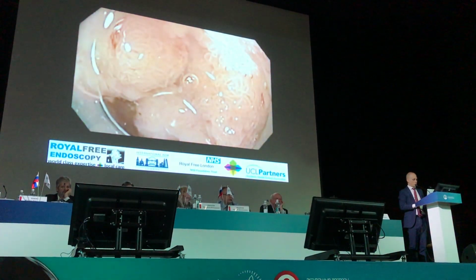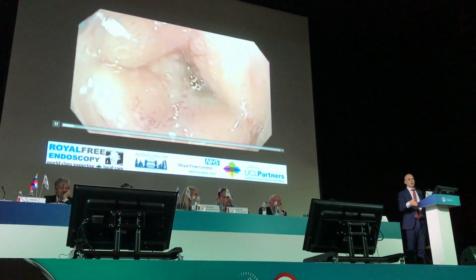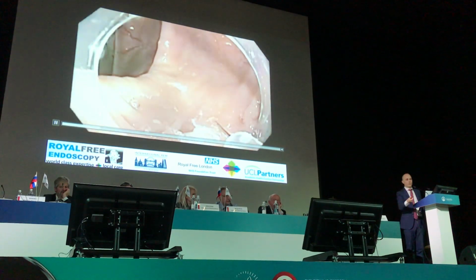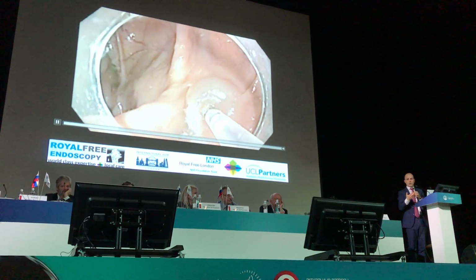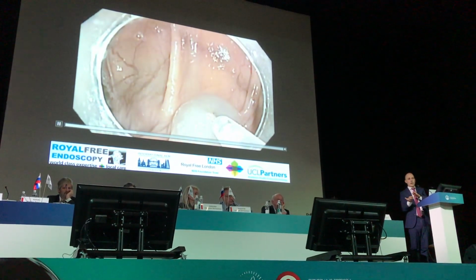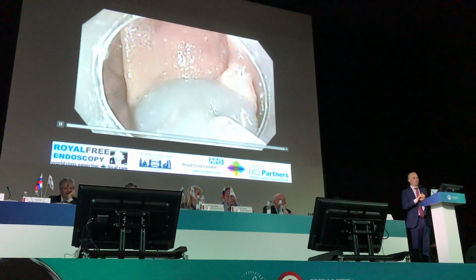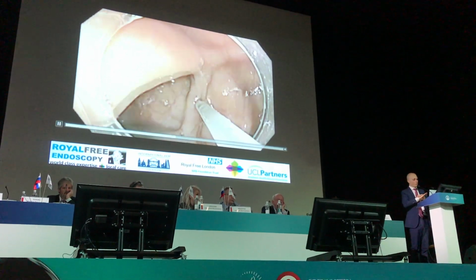So this is a video about circumferential tattoo. Why do we need to do circumferential tattoo for cancers? Because for a laparoscopic surgeon, it's very important to identify the tattoo, and if you perform only one tattoo, it might lie in the blind part of the colon, and the laparoscopic surgeon wouldn't be able to see it. With 3 or 4 tattoos, they will see for sure.